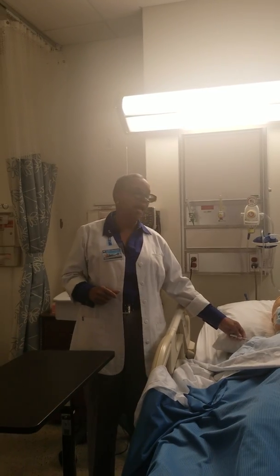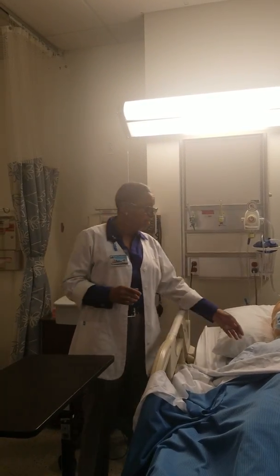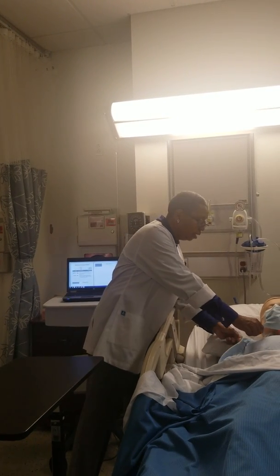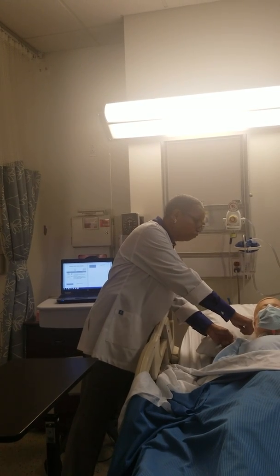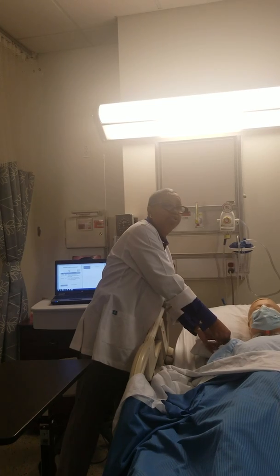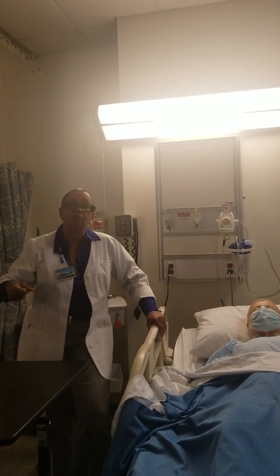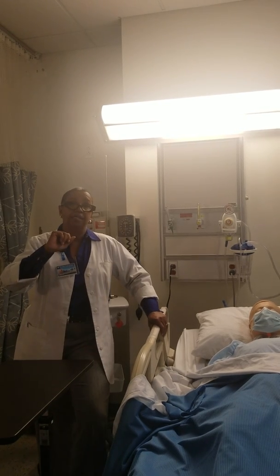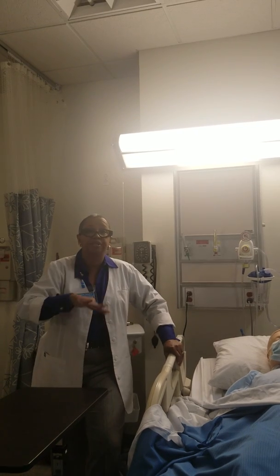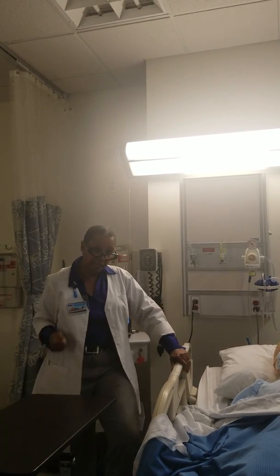The only thing about it is, typically this is sutured in, so it's not going anywhere. But anytime you tug on this, you have to make sure you're securing it. You can hold it down here, clean here, back and forth, back and forth. I can't let this go all the way out here. Next thing you know, I'm getting contaminated. Definitely it's a rigorous back and forth motion when you use chlorhexidine. When you use iodine, you're doing a different approach, like a circle. But if you go to their website, they'll tell you to move it back and forth.